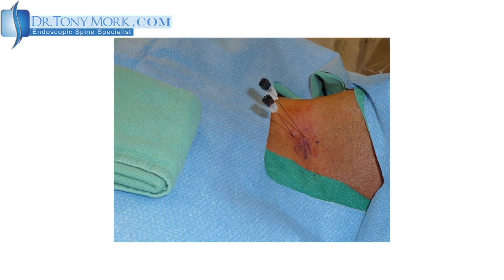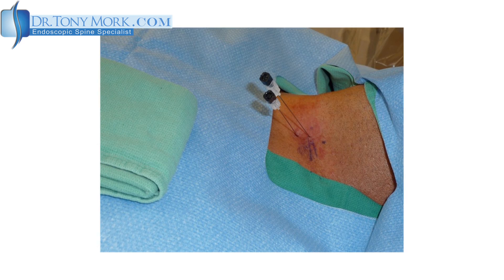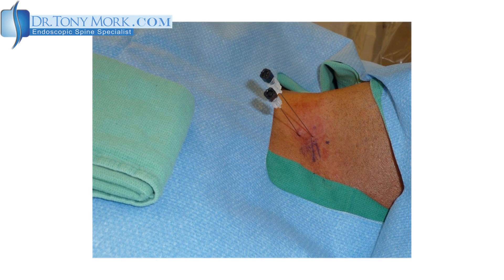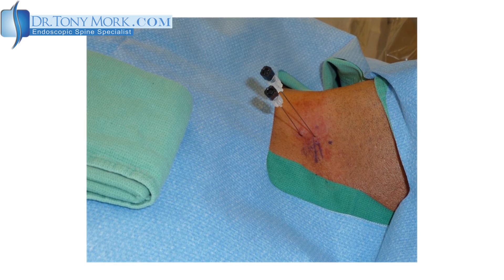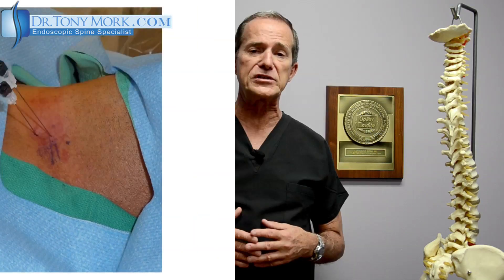Spinal pain mapping is a technique that allows us to identify what particular structure is causing your particular pain. Sometimes these structures can radiate pain to the same area, so it's important to know which structure is causing your particular pain. As you can see here, this patient has a couple of small needles into the side of the neck. These are discogram needles and they're used to inject a small amount of dye into the disc. This dye can cause some pressure which might mimic back or neck pain, or it can show leakage of the dye out into the ligaments, or show the contour of a bulging disc pushing on the nerves. In any event, this can help to identify where the pain is coming from and where surgery may need to be performed.